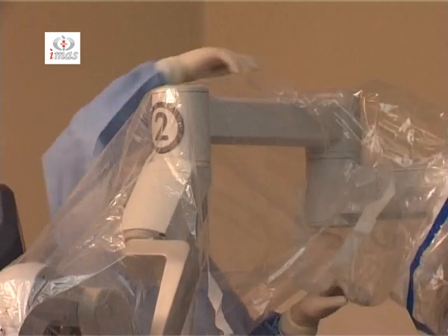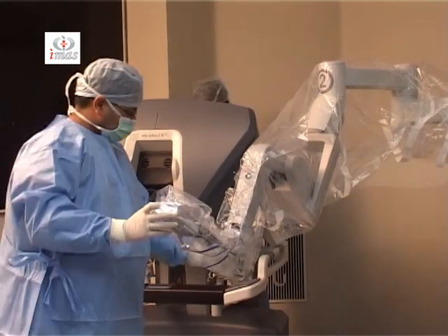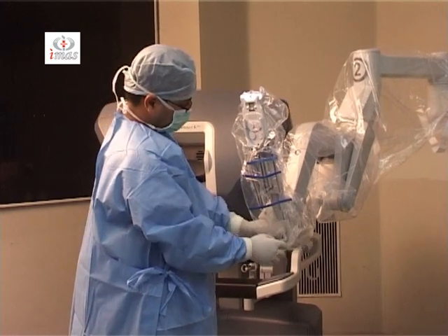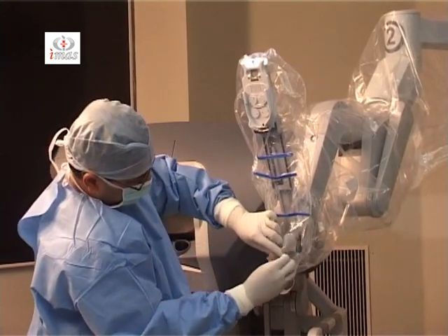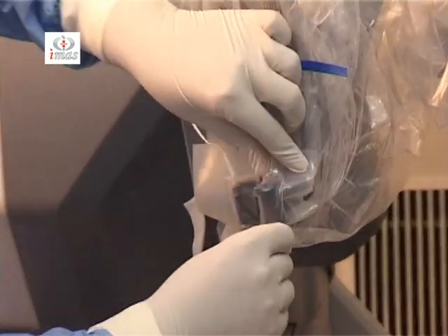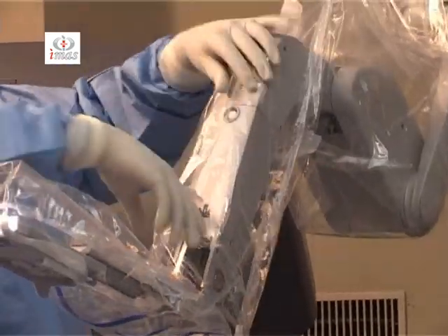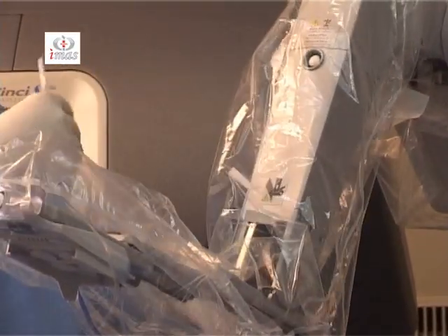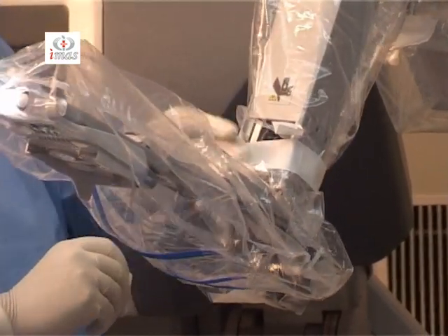The unsterile person can hold the drape distal to the blue line and set the drape right in the quick cannula mount as well. All this has to be done using the port clutch and the clutch buttons. Once this is set in the quick cannula mount, press the clutch, open up the arm, and apply these tapes around so as to fix the drape.